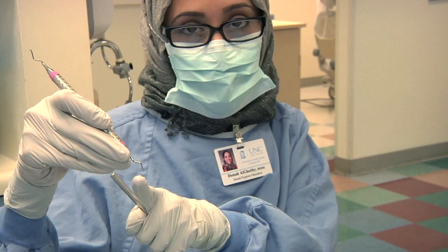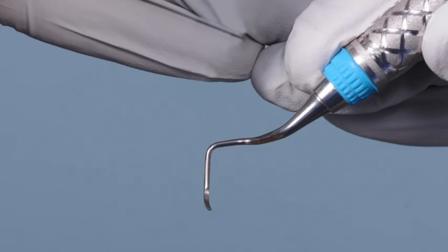Visually identify the correct working end by holding the instrument so that you are looking at the toe of the working end, and so that the lower shank is perpendicular to the floor. While looking at the cutting edges, visually identify the cutting edge that is lower or closer to the floor to be the correct working end.